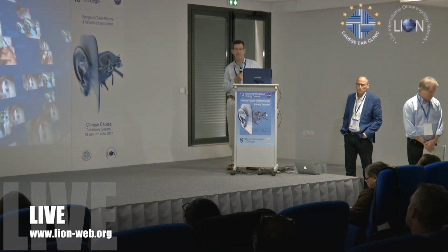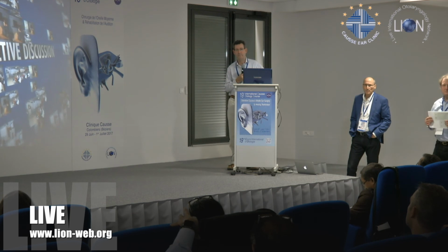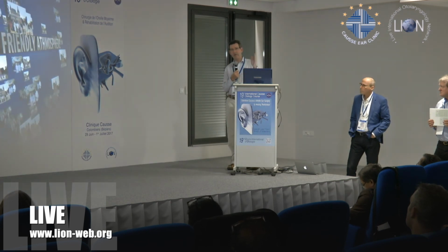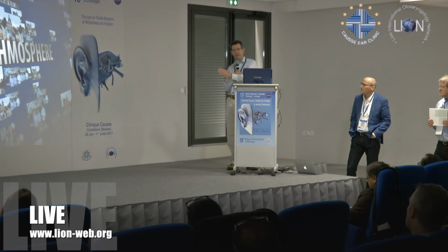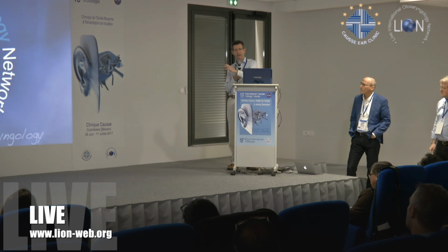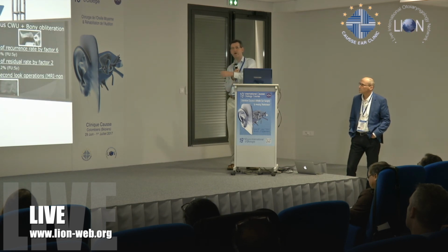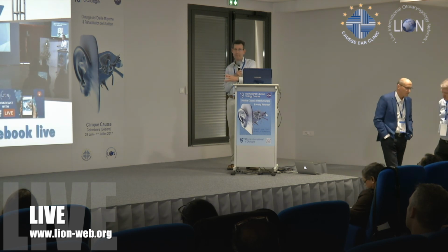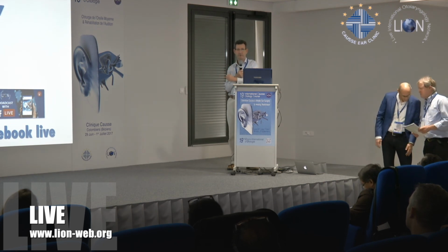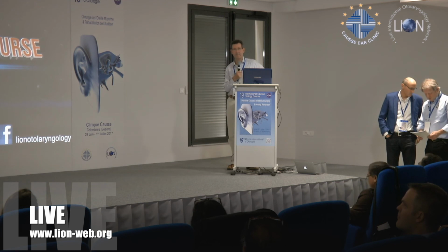The second question I have is, I played with the Dermalock coating on abutments for a bit, and I had a couple of really bad reactions to the skin. Have you seen that with the Dermalock coating? No, I haven't. Look, back in 2009 I started using a linear incision and no soft tissue reduction, or very limited soft tissue reduction, and using longer abutments. And immediately, much better outcomes, and low incidence of problems. At the same time, Cochlear, the company, changed to the Dermalock. And I personally don't believe that it was the new coating that made any difference. I think it's a different surgical approach. But I haven't seen any excessive reactions that I'd attribute to the hydroxylapatite coating. Okay, thanks so much.